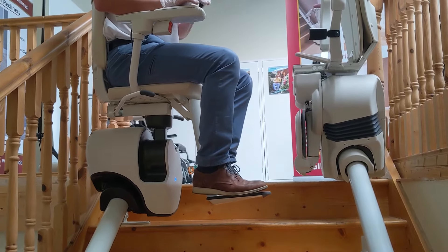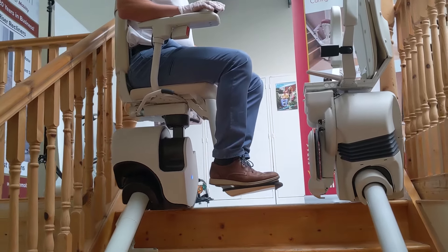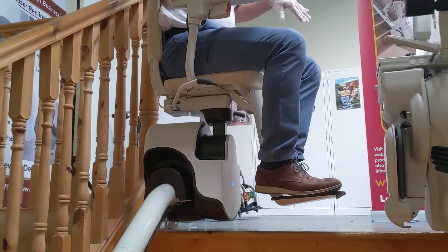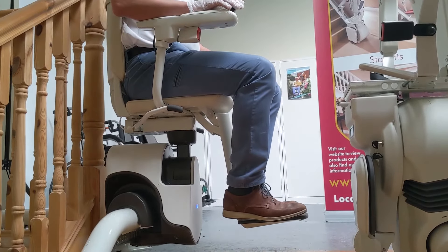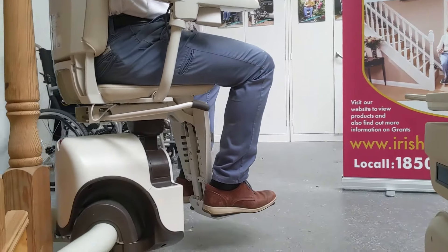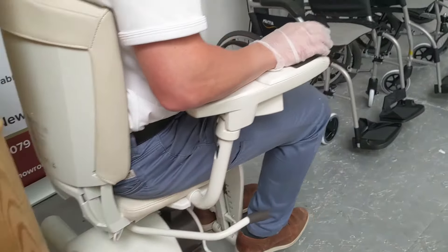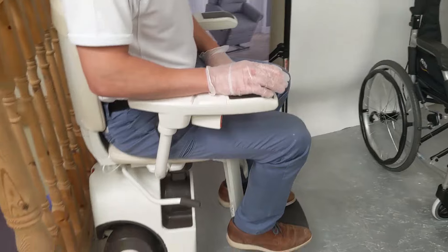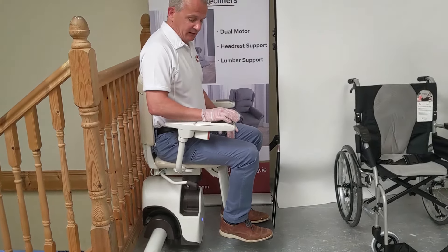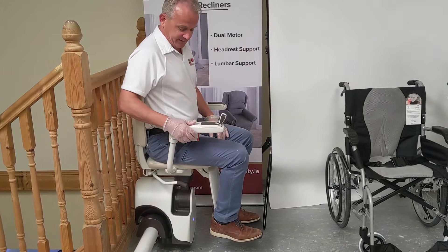In this particular staircase we have a 90-degree top park. When it gets to the top of the stairs, you sometimes have the facility in your own home for it to be parked at the top rather than finishing at the nose. So this is just a 90-degree park — it comes around the corner and stops automatically at the top. You're nice and safely at the top and it cuts out itself.